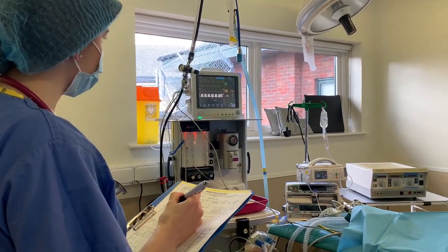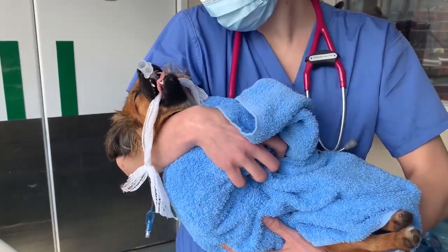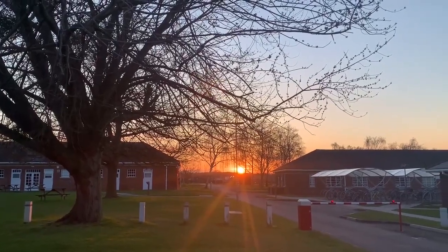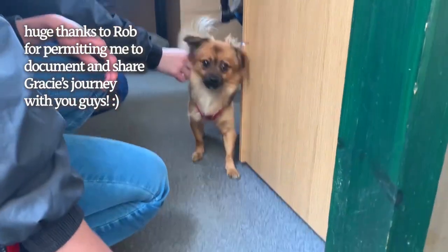I would recommend checking out Everyday Vets channel for more details on a bitch spay. As the procedure is done, our patient is transferred to wards where my colleague will monitor her for a smooth recovery from the anesthesia. You'll be pleased to know that she's doing fine after her operation and is being the cutest and bravest girl ever.